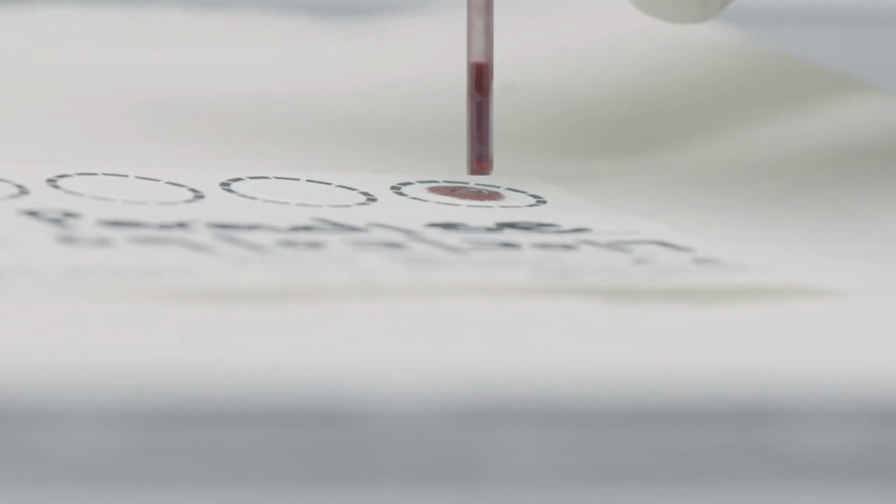You can also use a microcapillary tube to collect the blood. When using a microcapillary tube, you should also try to collect 5 completely filled circles. If that is not possible, try to obtain at least 3 full circles. It is also possible to use EDTA microtubes to collect the blood instead of a microcapillary tube.